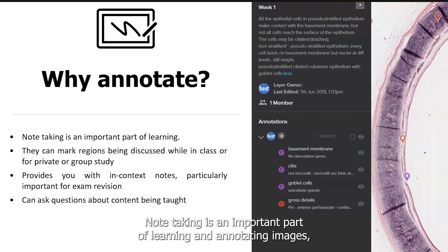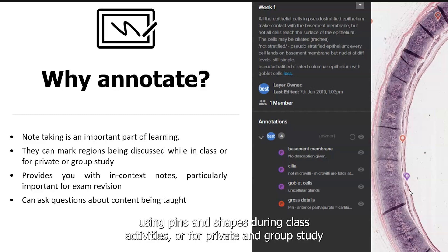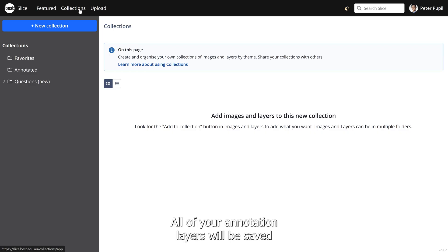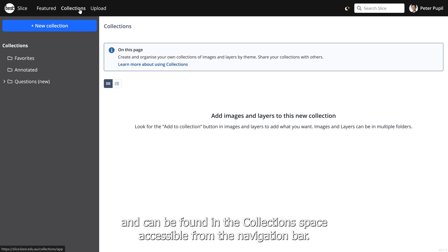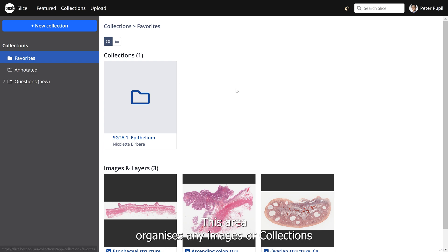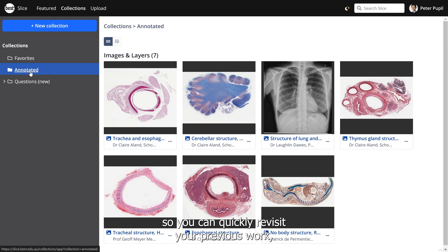Note taking is an important part of learning, and annotating images using pins and shapes during class activities or for private and group study can help with learning histology and histopathology. All of your annotation layers will be saved and can be found in the collection space, accessible from the navigation bar. This area organises any images or collections you have marked as a favourite and any images you've annotated on, so you can quickly revisit your previous work — perfect for exam revision.